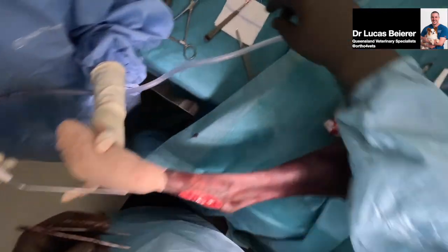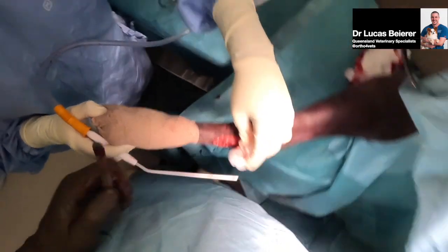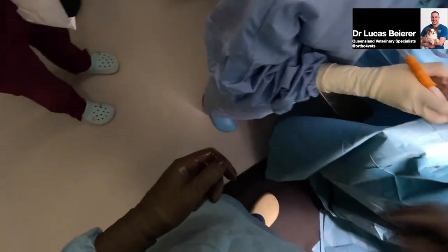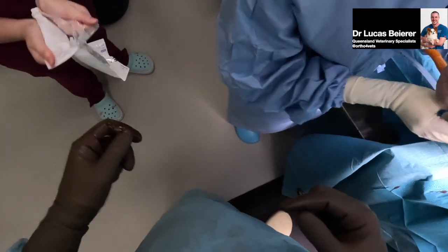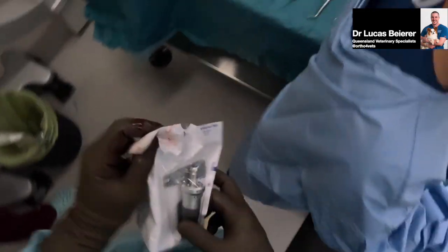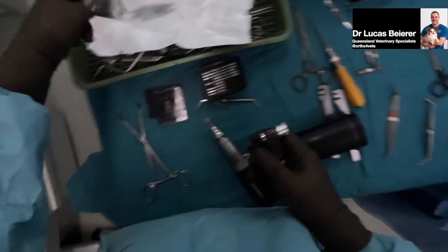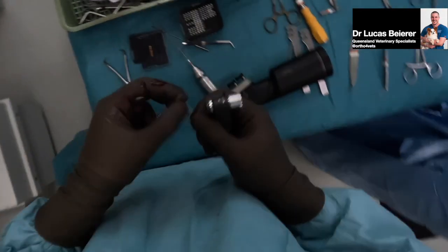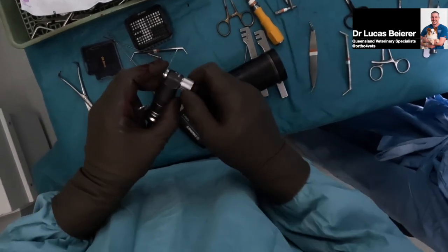Yeah, thank you. So we're just going to get the oscillating saw so that we can create a smooth, flat surface for our plate to reduce the tension on the soft tissues. You can do it with a burr as well. The burr is just a little bit more cumbersome when it comes to opening more equipment, so this is a little bit more user-friendly. So we'll just take off the top part of the metatarsal.